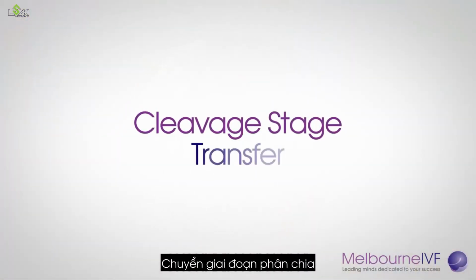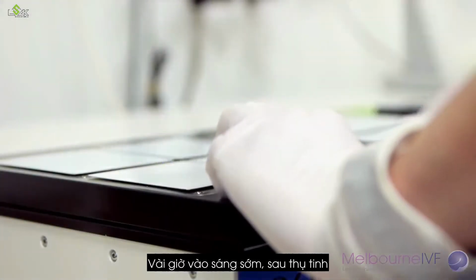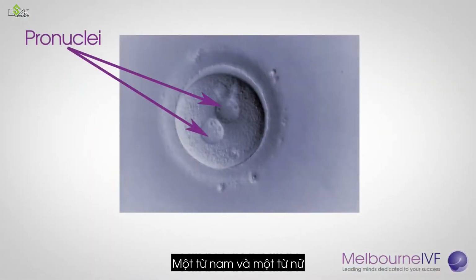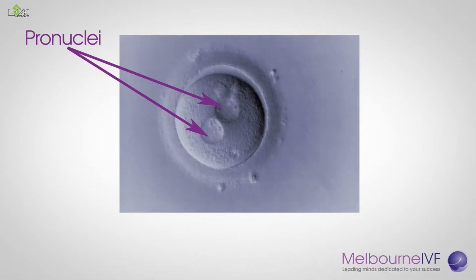Cleavage stage transfer. The day after egg collection, morning. In the early hours after fertilization, the egg begins to display 2 pronuclei in the center, one from the male and the other from the female. These are observed under the microscope at this time to confirm that fertilization has taken place.